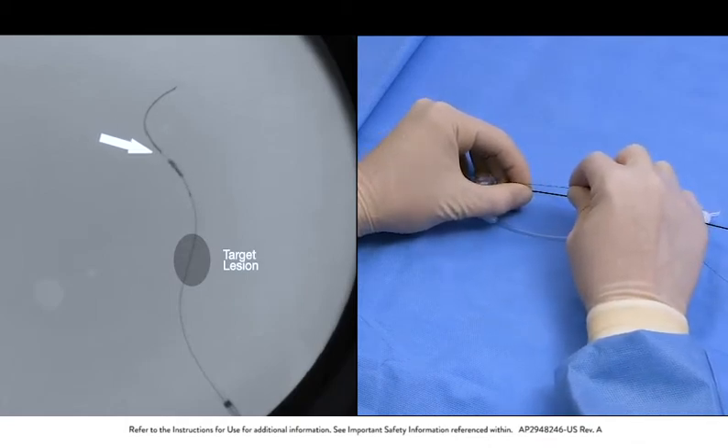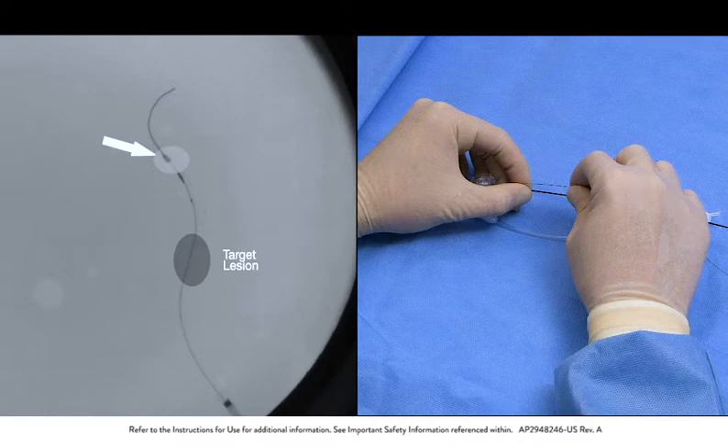Continue to retract the bare wire until the filtration element is fully enclosed in the radiopaque expandable tip of the retrieval catheter. Filtration element retrieval is complete when the distal marker band on the filtration element is within 2 mm of the distal end of the radiopaque catheter tip.